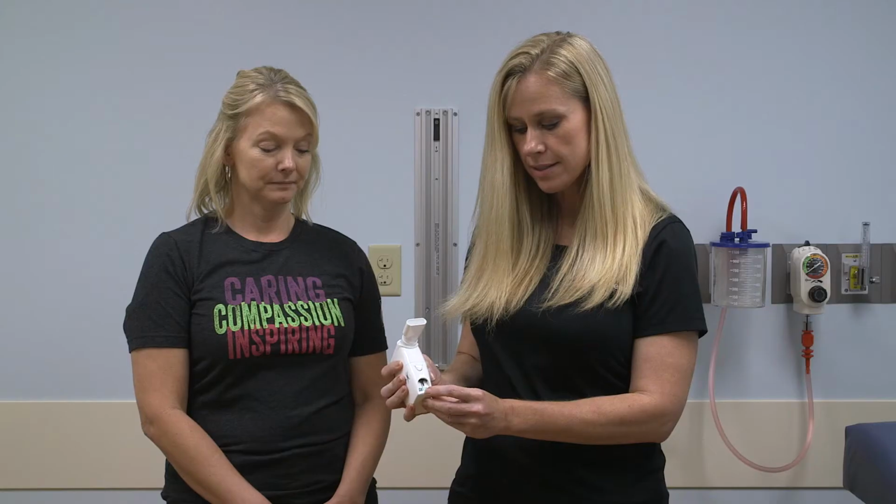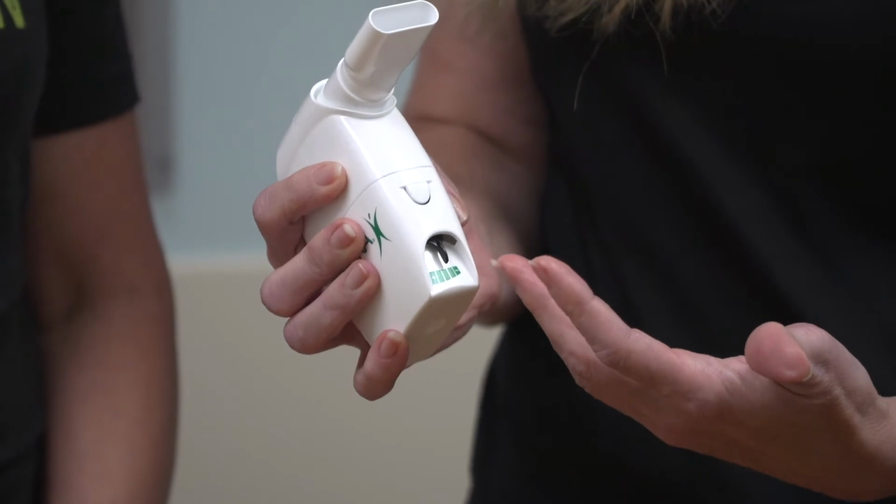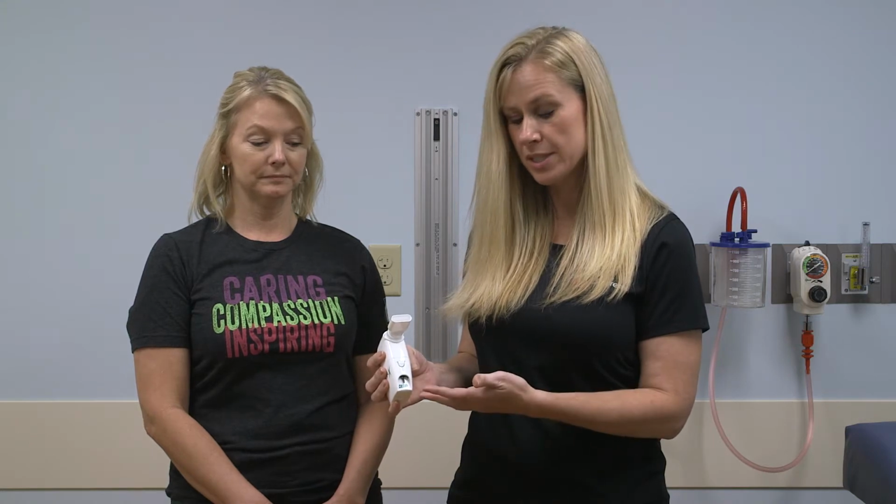A couple things about the device. It has different resistance settings, which is just your positive pressure. So when they breathe against the resistance, it causes a positive pressure in the airways that kind of pop open, so air gets behind mucus and pushes it up.